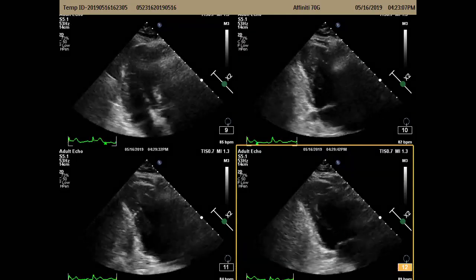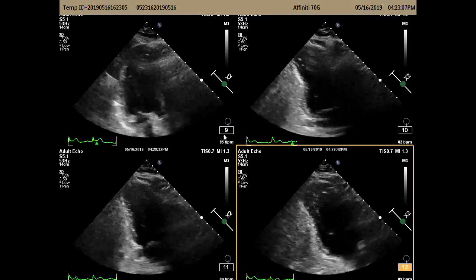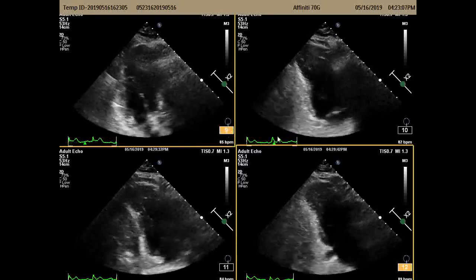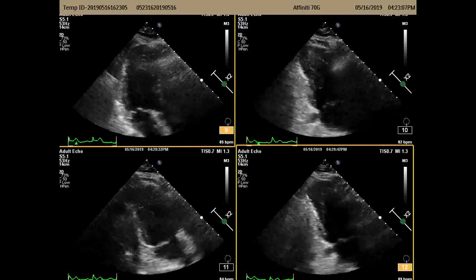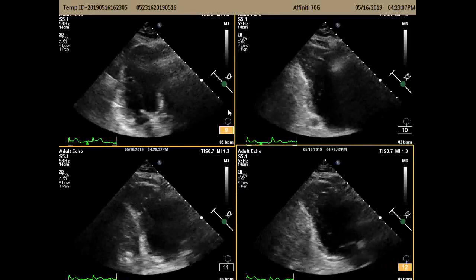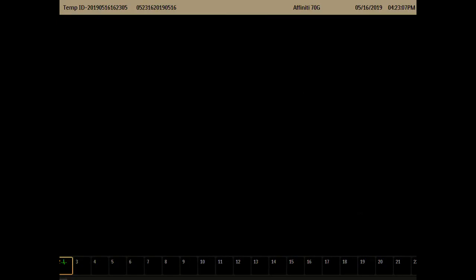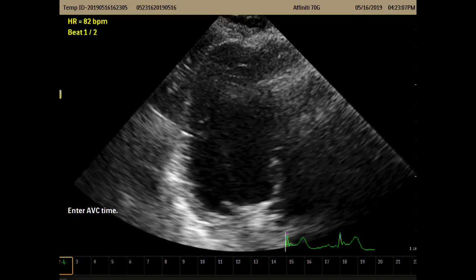Close QApps. I just got to highlight this one, that's our 2. Then I need a 4. Can I choose one from over here? Right? Okay. So here's our 4. We're going to start with our long, or I think Ashley might have used the word 3-chamber. 3-chamber is long. They're the same thing.